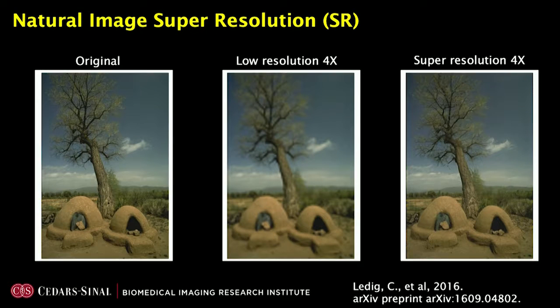So in this work, we're trying to explore a new avenue for additional acceleration by doing super resolution. Natural image super resolution is actually a classical problem in computer vision. And with the renaissance of convolutional neural networks, there's been a lot of improvement in performance in recent years.